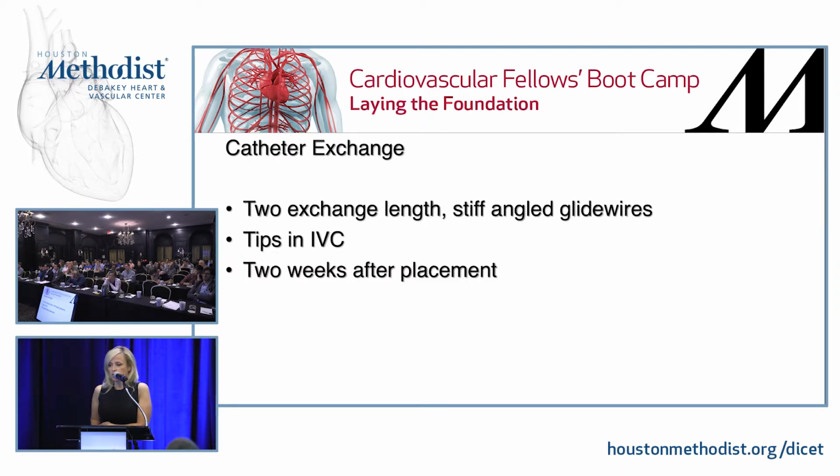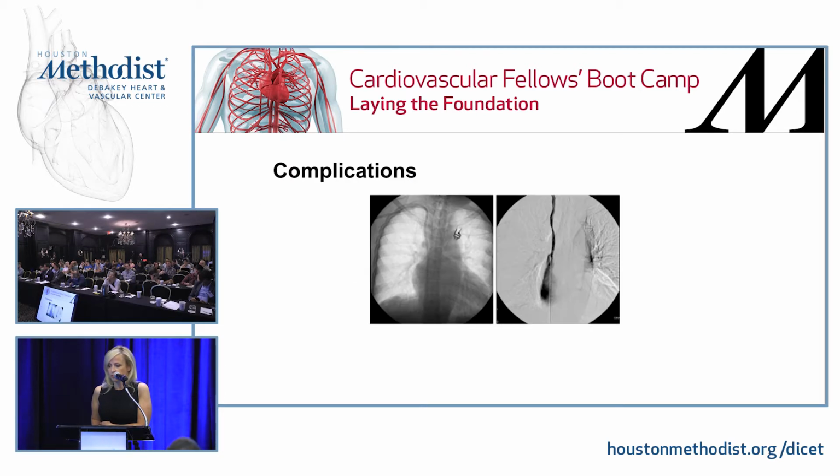So for catheter exchange, we generally use 2 stiff Angle Glide wires. Generally, it's better to do this if the catheter has been in for 2 weeks because you have a well-developed tunnel. The tips of the wires are in the IVC when you do that exchange.